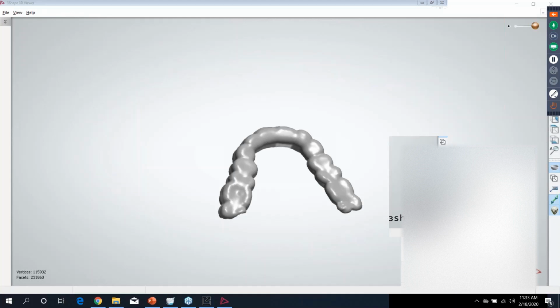Okay, a couple questions from Sergey. Could your resin be adopted to work with Sirona's Cara printer? If yes, how do you do it? Thank you. Probably not, to be quite frank. The Cara print printer, they lock it down pretty tight.